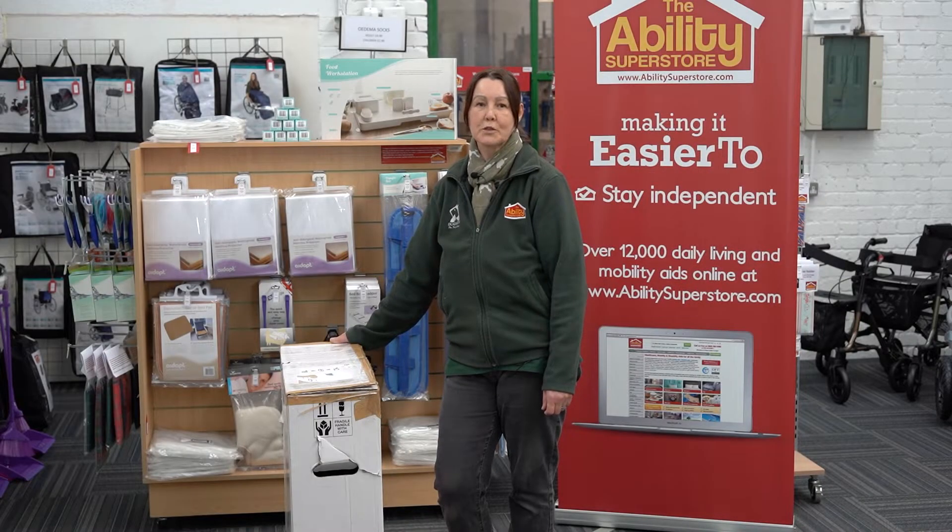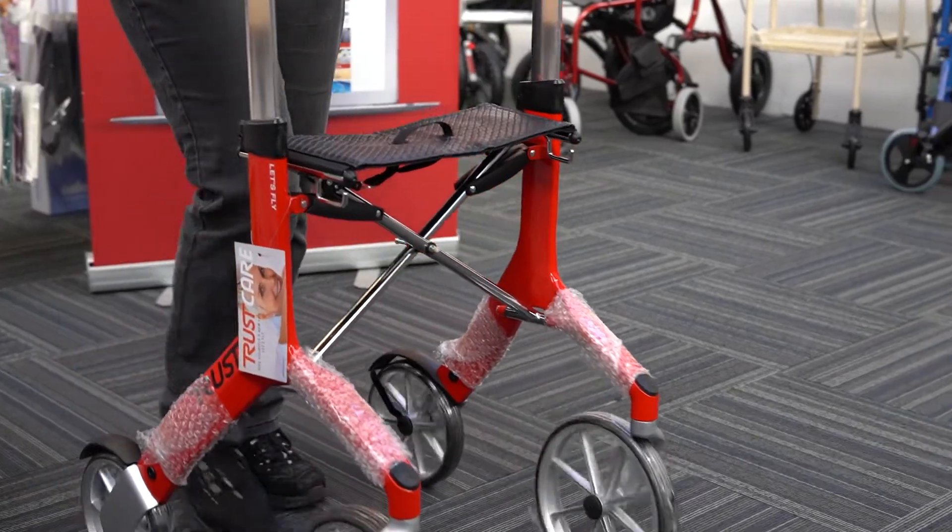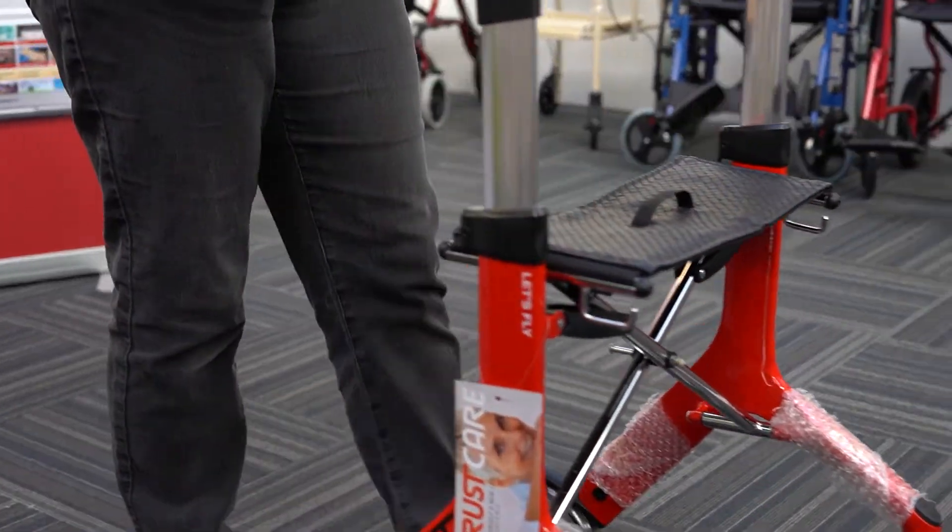Hi, I'm Carol from Ability Superstore and today I'm going to show you how to assemble a Let's Fly Rollator. First things first, let's take it out of the box.